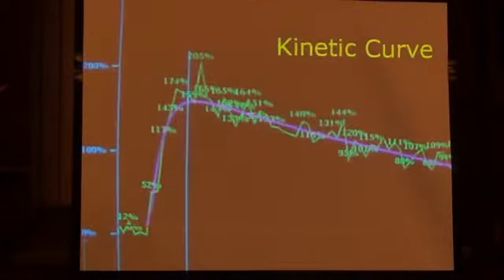And now we've taken it and translated it into prostate. So anything that's red says, look here, you might have a problem. This is something that's hot, it's a hot spot. Take a look at this. And then you correlate it with all your others.